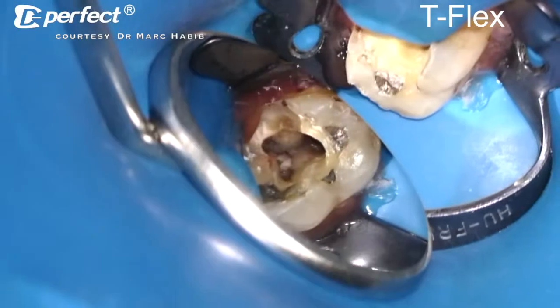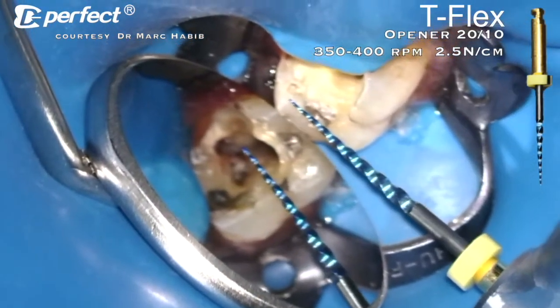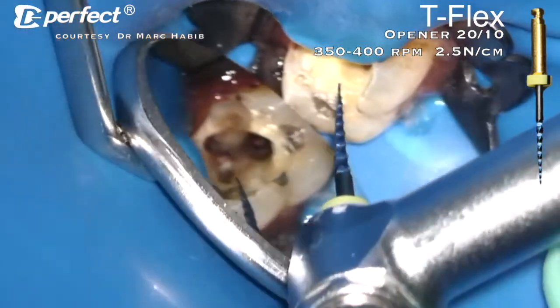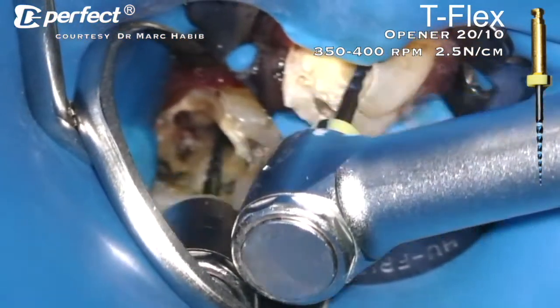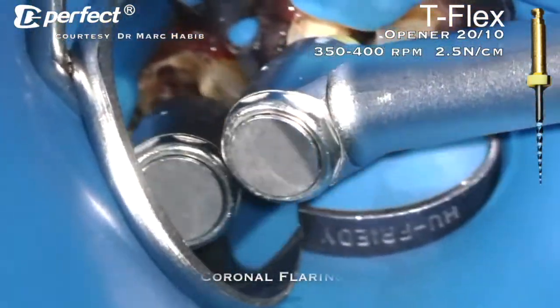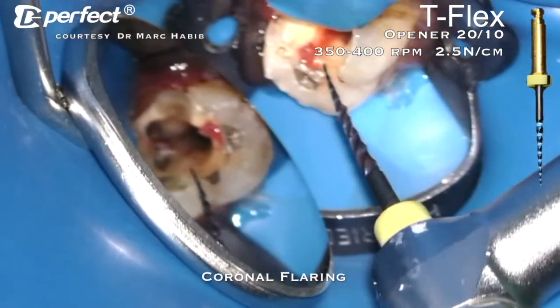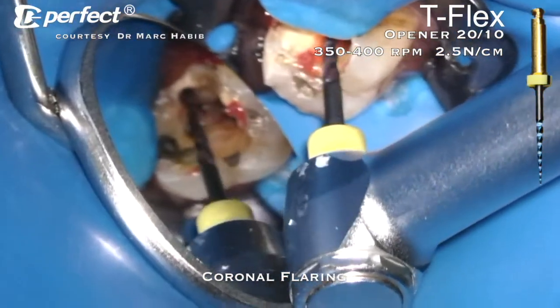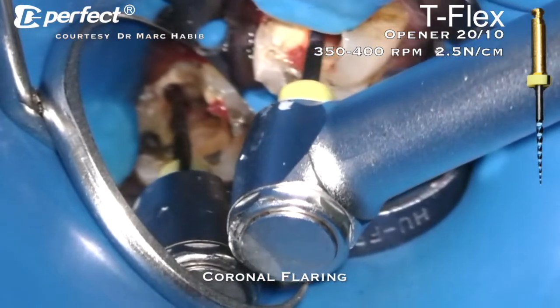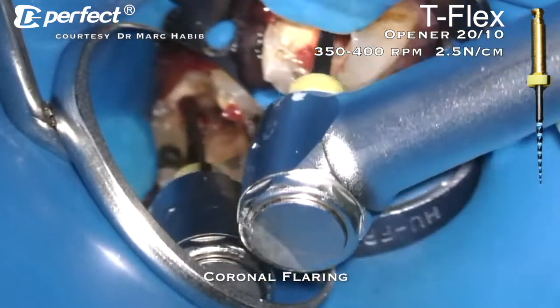After the access cavity was done and the caries was cleaned, we are using the first instrument from the T-Flex system, the opener. The opener is a coronal flaring instrument which is 20 at the tip and 10% taper, very flexible, very active instrument that will eliminate the coronal interference before accessing the deep parts of the canal.